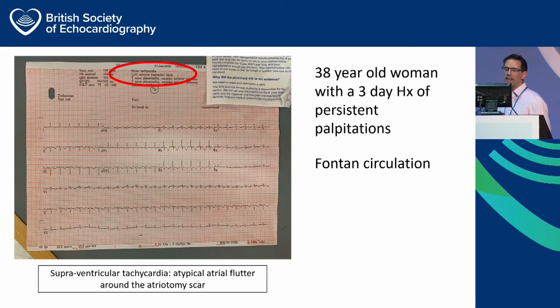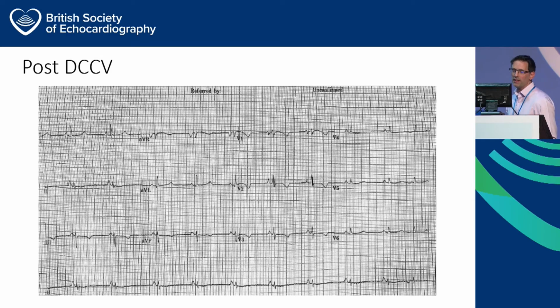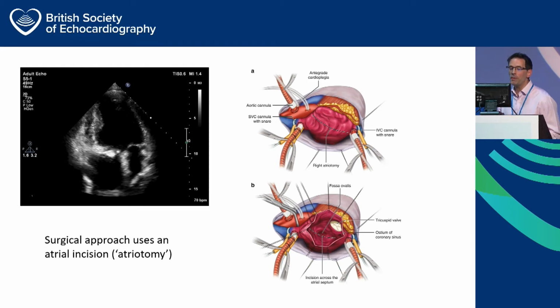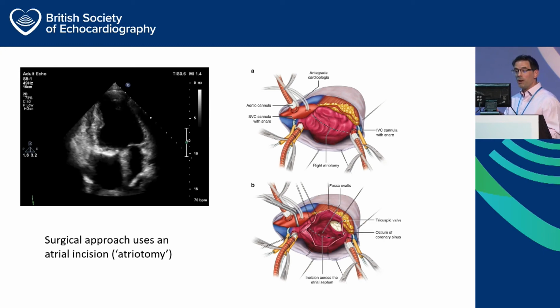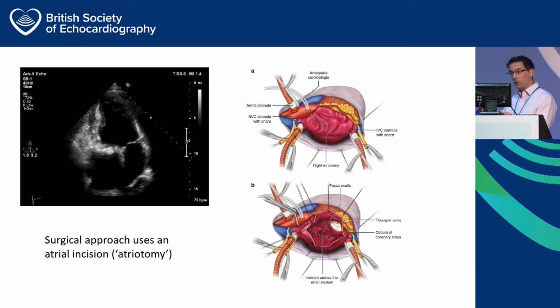The treatment is electricity, and I'll show you the surgery in a second. But if you don't believe me, that's her having had DC cardioversion quite safely in theatres, and we got her heart back to sinus rhythm, and it shows you the abnormalities to the T waves consistent with her single ventricular circulation.